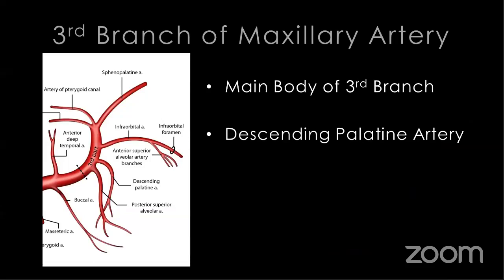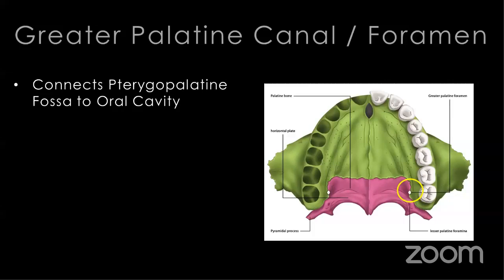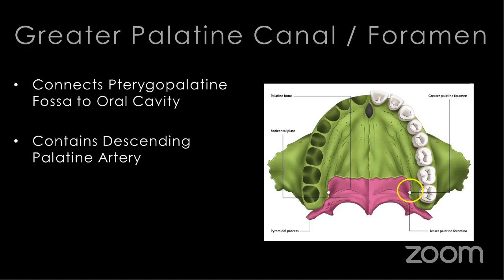These are really, if we're utilizing the correct length of implant and the correct angulation, the ones that we need to be concerned about. All the other branches, if you're hitting those, you're really doing something really, really wrong. You're really off angle. You're using something way too long. So in terms of the descending palatine artery, we're talking about the greater palatine canal, the greater palatine foramen. This is connecting the pterygopalatine fossa to the oral cavity, and this is where you have the descending palatine artery.